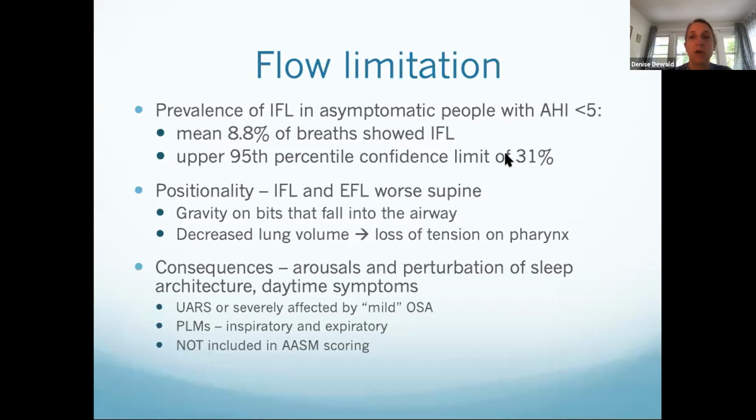So this is someone who's not being captured by our definition of sleep apnea, but is maybe symptomatic from sleep disordered breathing. So this is someone that I would try treating their sleep disordered breathing before saying, oh, you've got idiopathic hypersomnia, or you've got insomnia because of all sorts of other things.